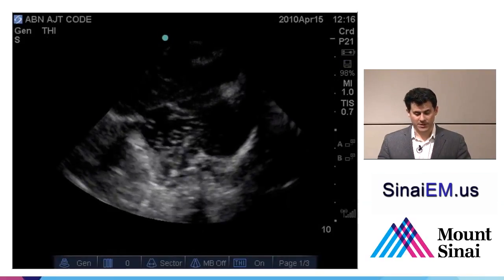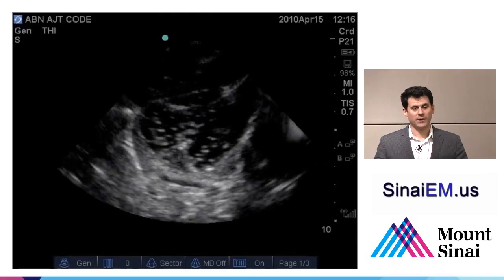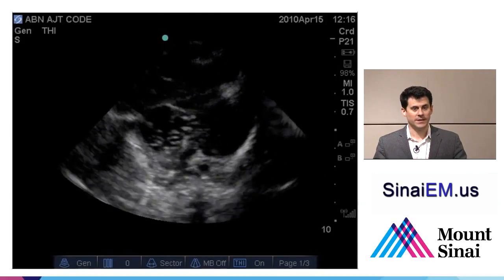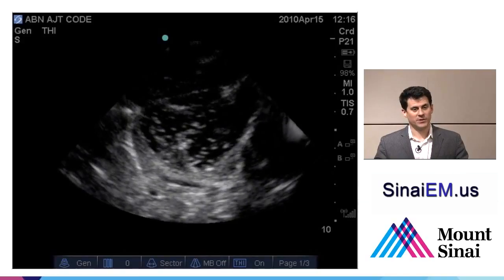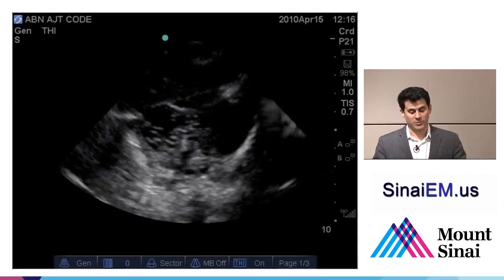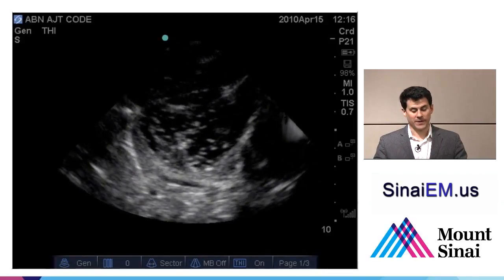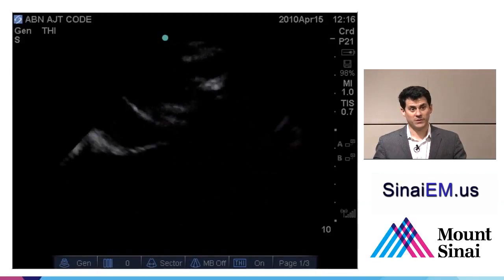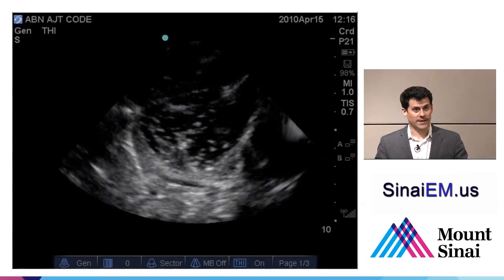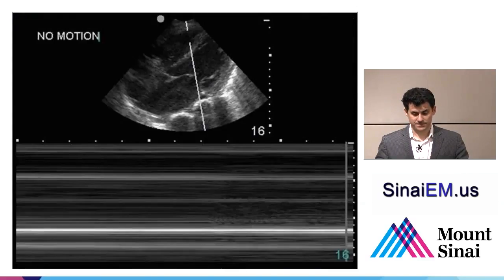And yet one more example here where the practitioner had their probe ready in the subxiphoid area. That's why we don't see the image in the beginning here. And then when the chest compressions stop to allow for the pulse check, you can then quickly manipulate the probe to the point of being able to see the heart. And there's just sort of a gentle swirl of fluid in the heart, probably left over from the chest compressions, and certainly no cardiac activity in this particular code.